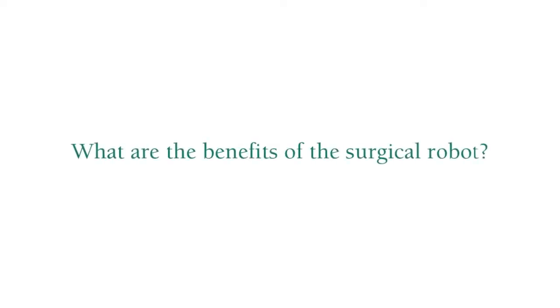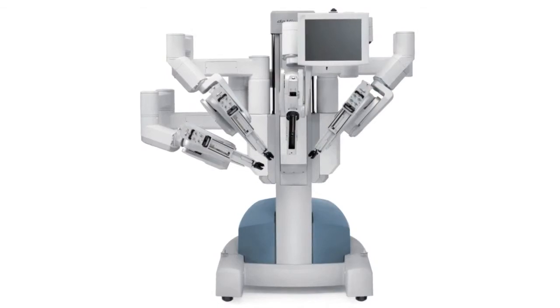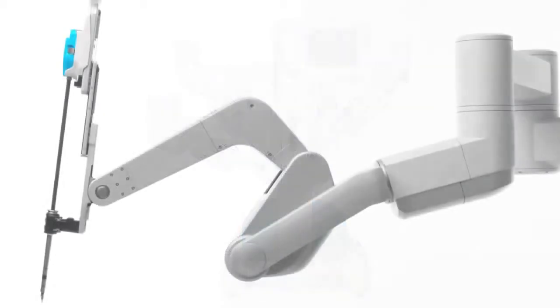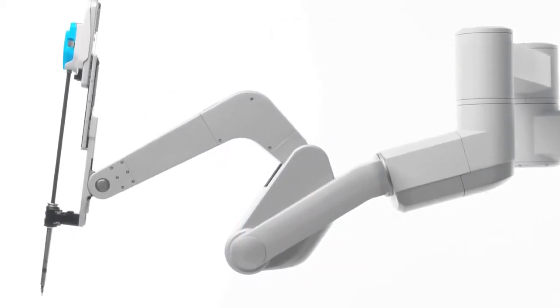A surgical robot is basically a mechanical and computerized interface between the patient and the surgeon. The robot allows the surgeon better visualization, which is the main and the first benefit, and then better manipulation, all through minimally invasive access points in the abdomen. That's mainly where we use the Da Vinci robot here, is in the abdomen. Different specialties use it for many different procedures, but all of them are done through tiny little holes that are just big enough for your finger to go through.